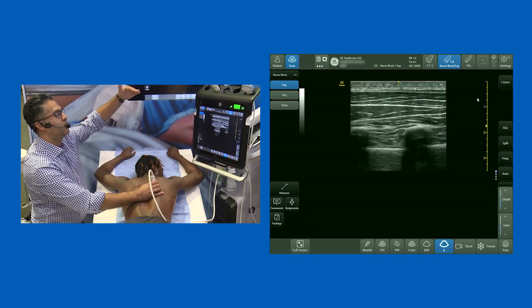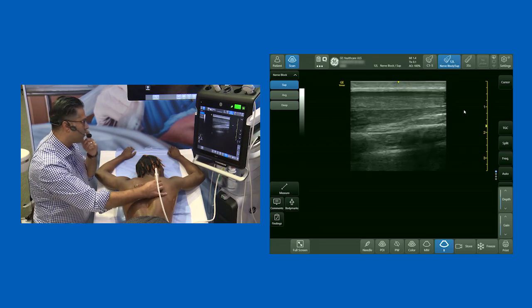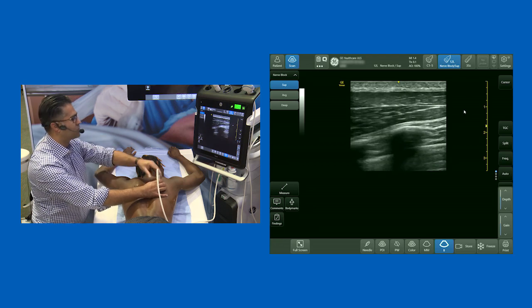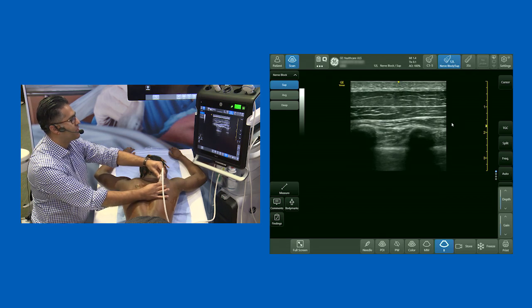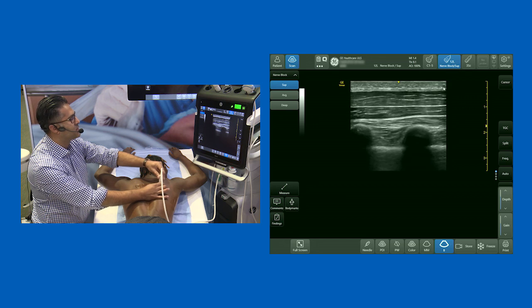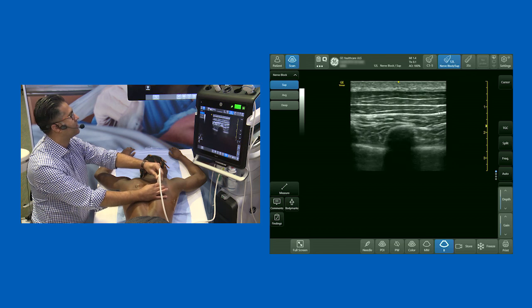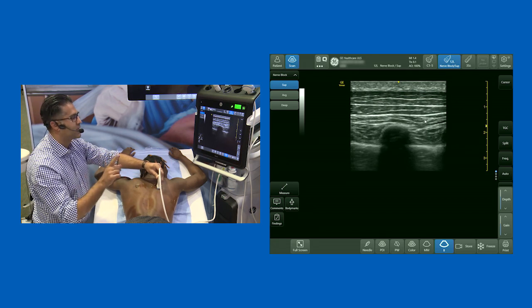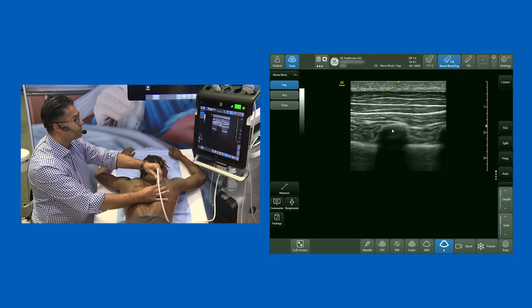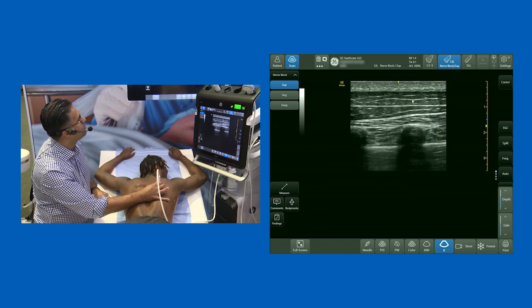I'm going to take you through the approach from superficial to deep, and I've intentionally started out way lateral. My probe is orientated in a parasagittal orientation. We've got a very thin layer of adipose and then we start to see some muscle layers. What's really nice is you can see three very clearly defined muscle layers. I'm way lateral from the midline, so I know I'm scanning over the ribs. We've got trapezius — that top muscle right there — and below that is the rhomboid muscle.